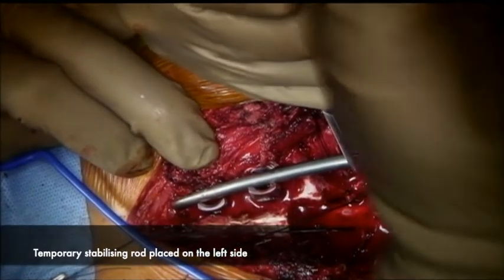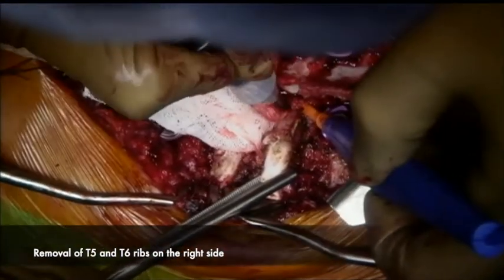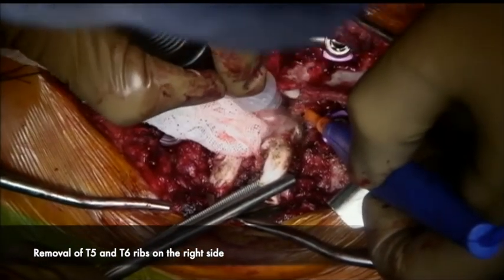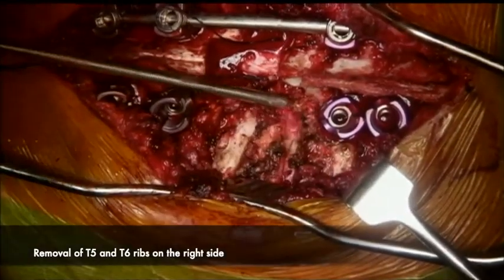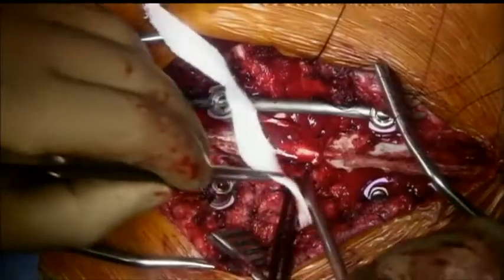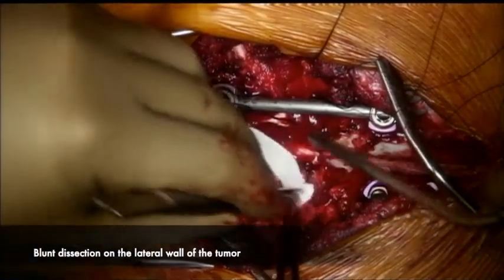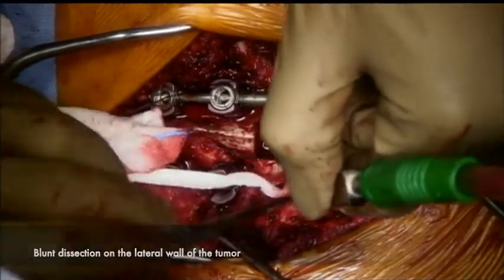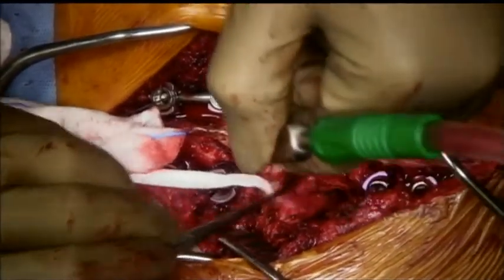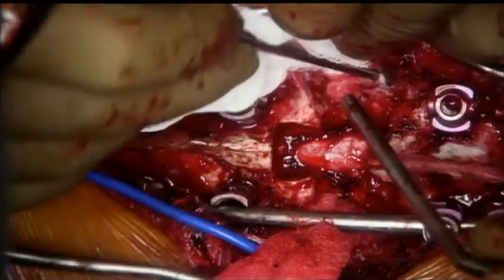A temporary stabilizing rod is placed on the left side. Because of the close approximation of the tumor with the right T5 rib head, that rib head is left behind next to the tumor. Similar steps to remove the T5 and T6 rib on the right side are then done. Blunt dissection along the lateral wall of the vertebral body is performed with a ribbon gauze, and a plane is developed on the left side as well.